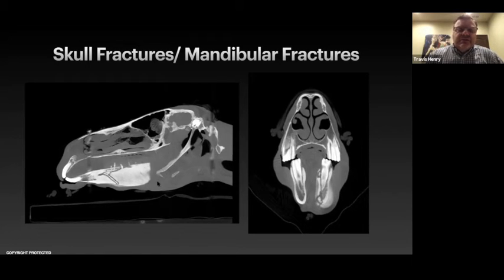What was very interesting is you would look at this case radiographically and see these sequestra and all of the small pieces and think that we were going to have to intervene and go in and debride all this out and clean it up. And this horse, honestly, we followed with CT, and I never took any of these pieces out. This horse healed up entirely. It's kind of amazing to me that this was a case where CT helped me pump the brakes and not go into an older horse and open up the entire jaw and remove tons of sequestra and debride a lot of things. Once she was on an appropriate antibiotic, everything started to settle down, and she healed very well without any major surgical intervention. I was very surprised about that. And that first horse that we showed taught me the same thing, because once that horse was on doxycycline and appropriate antibiotics due to culture, things really settled down after the teeth were extracted and we could get things to heal up.